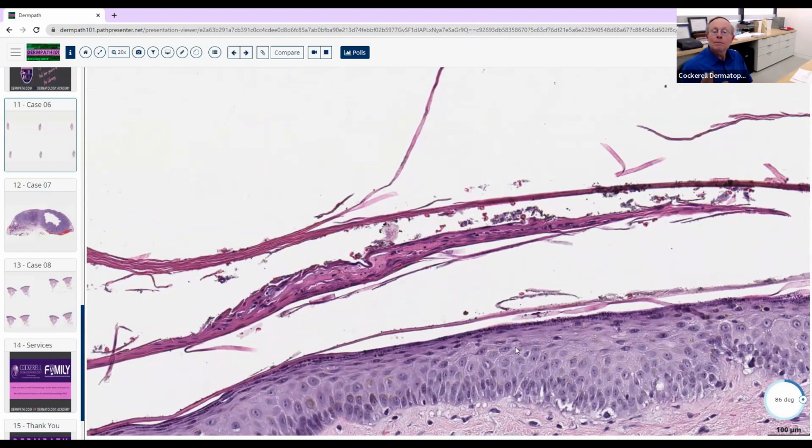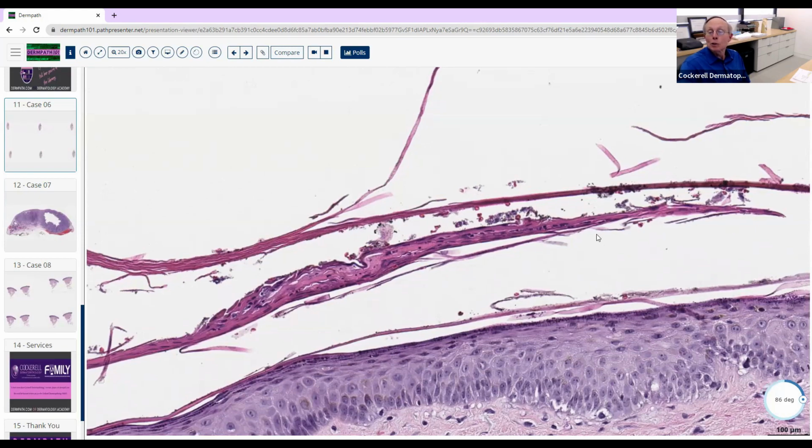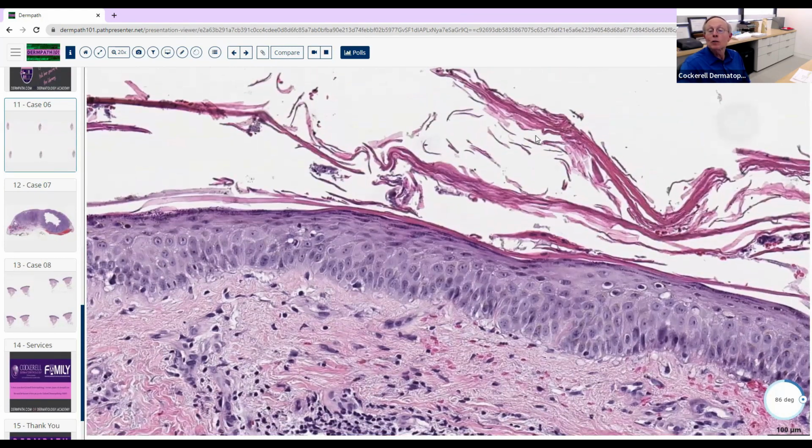So if you see 5 criteria for one diagnosis and one thing that sort of doesn't seem to fit perfectly, don't place too much emphasis on that one thing. Okay. So if you see this sandwich sign, normal basket weave cornified layer with parakeratosis and neutrophils in the sandwichy area there, you should surely think about these entities that you're mentioning.